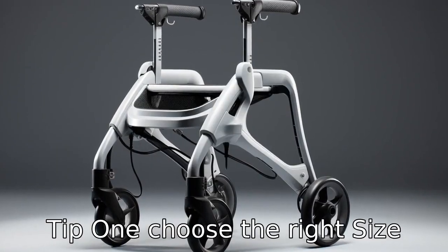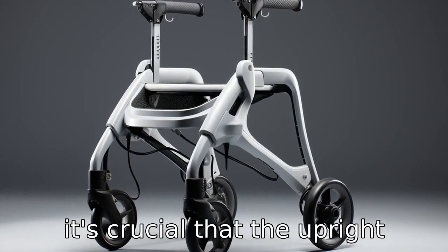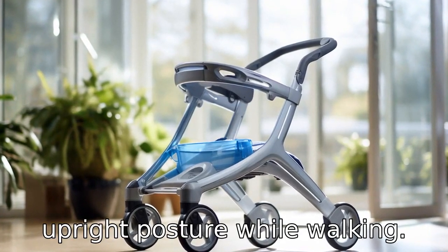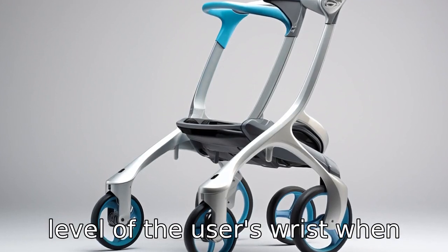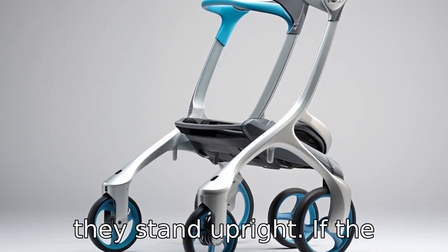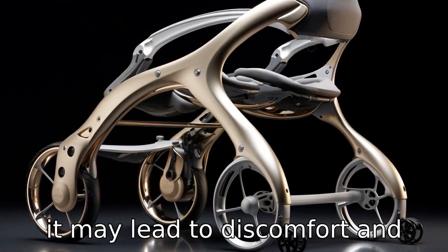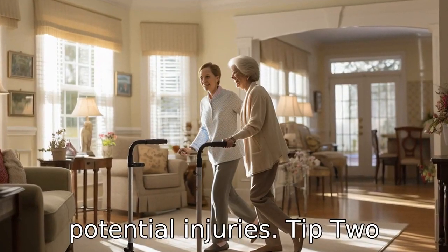Tip 1: Choose the right size. It's crucial that the upright walker is the appropriate height for the user to maintain an upright posture while walking. The handle should be at the level of the user's wrist when they stand upright. If the walker is too short or too tall, it may lead to discomfort and potential injuries.